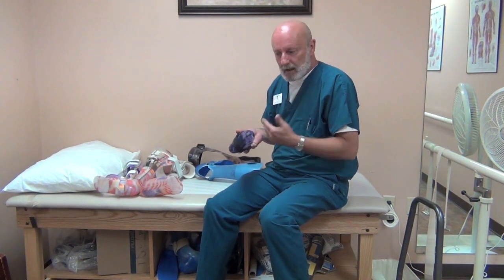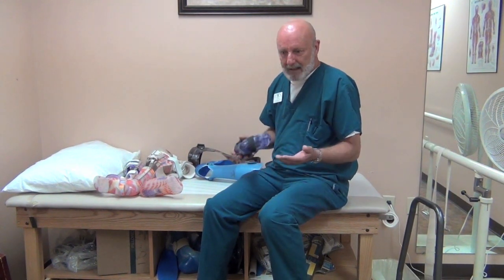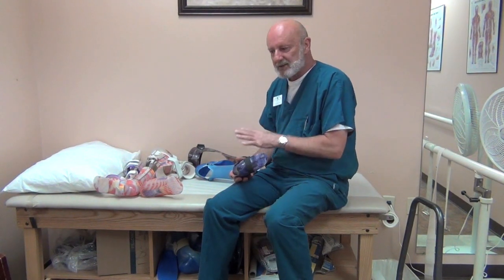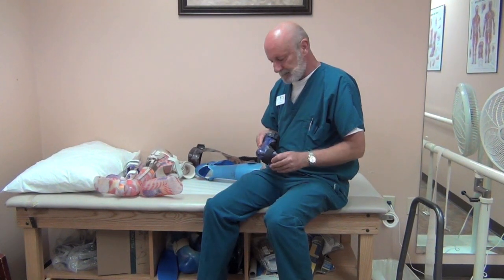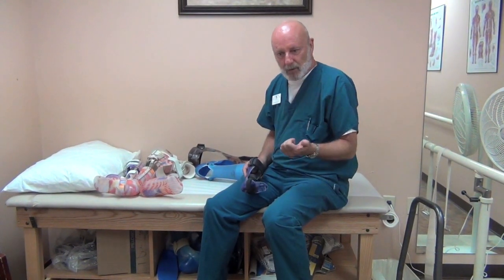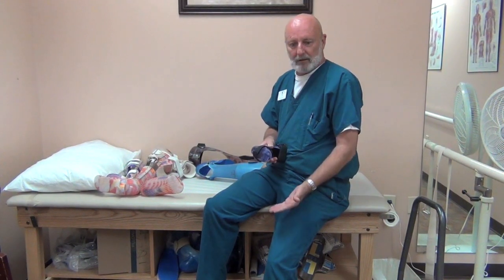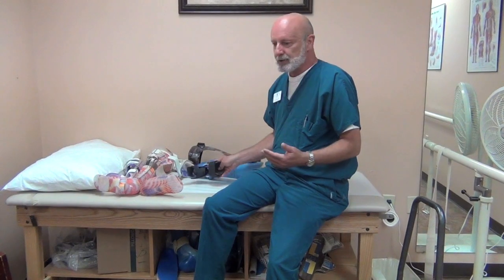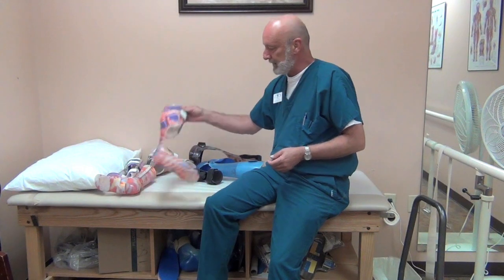These should be, if not comfortable, at least tolerable — they shouldn't cause any skin redness. With spina bifida you have loss of both motor nerves and sensory nerves, so you need to watch the skin very closely. Any redness lasting longer than 20 or 30 minutes needs to be addressed by the orthotist, because it can result in callus formation, blisters, or sores that can become a chronic issue. Patients don't feel a poor fit, but their skin will show it.